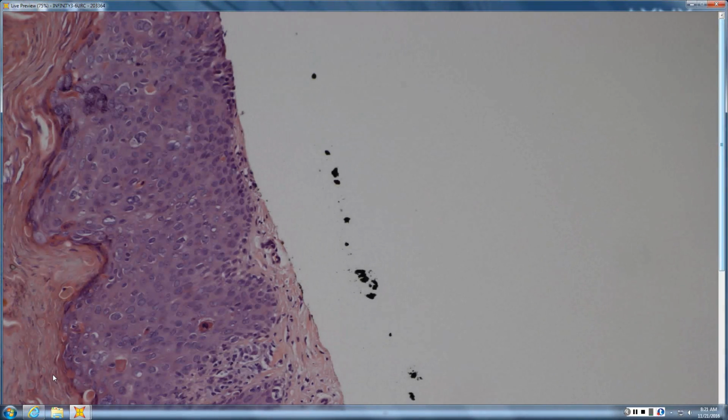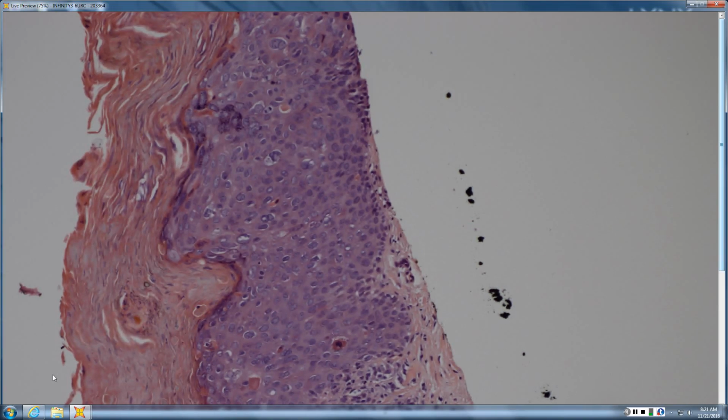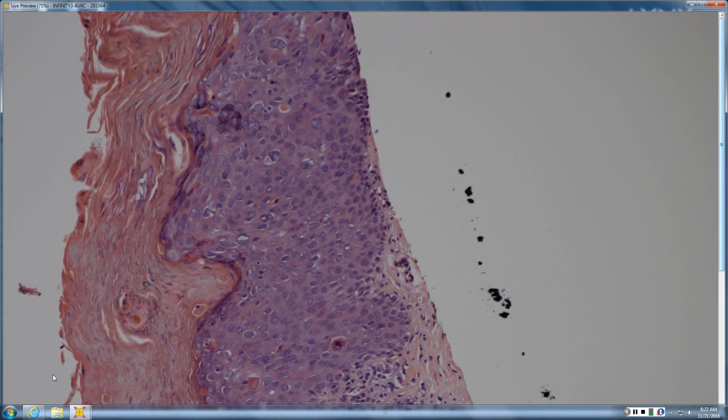I said Paget's. I guess you'd ideally stain those to make sure it wasn't Paget's versus melanoma versus Paget's disease. Yeah, and in this one, do the cells spit out intact or do they keratinize into a thick stratum corneum? They keratinize, so I guess you'd favor Paget's-like SCC, like a Bowen's. So a pagetoid squamous cell carcinoma in situ, so Bowen's basically. And Paget cells are not capable of keratinizing. Here, these cells produced a big, thick corneum. So that was a clue that it was Bowen's.